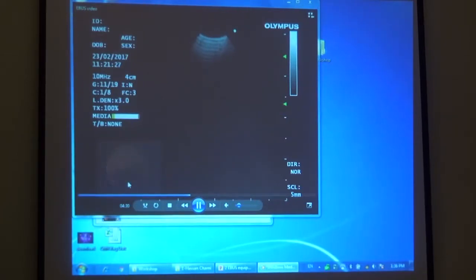And now you're going in the left main stem. All right, so here you're in the left. And now you've seen it from below, and you're seeing the whole mass now. So here you're in the left main stem. The tip of it is the AP. If you advance a bit, then it's the hilum. This is the whole mass. It's a very big lymph node.